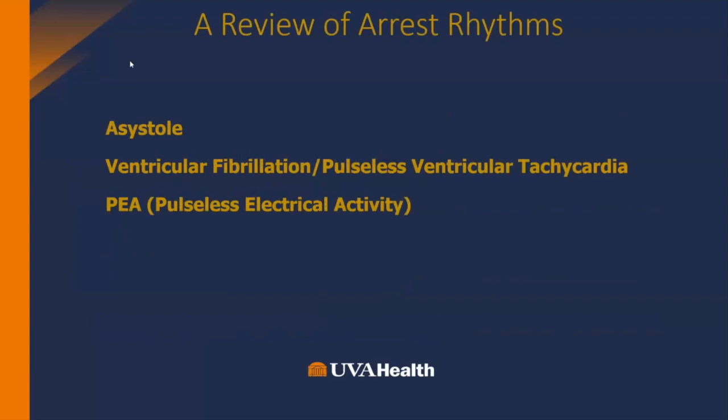So arrest rhythms: asystole, ventricular fibrillation, pulseless VTAC, and PEA. We're going to get into those.